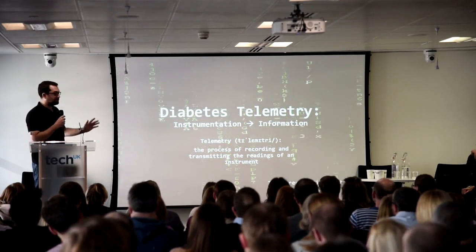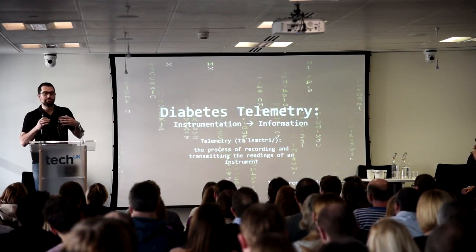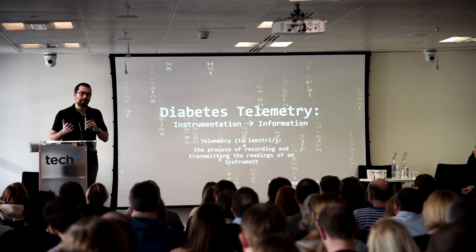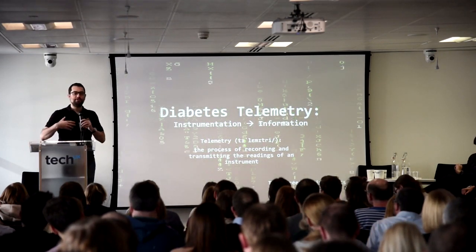Of course, telemetry is a term that probably most of us are familiar with. It's the process of recording and transmitting the readings of an instrument, usually remotely. In terms of medical telemetry, that's from within the body to outside of the body.